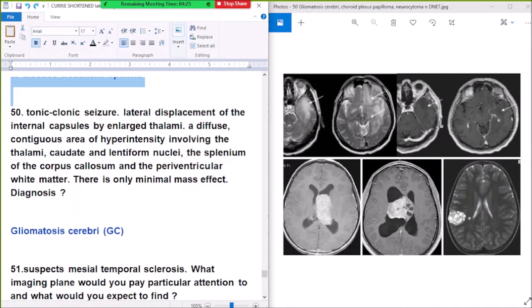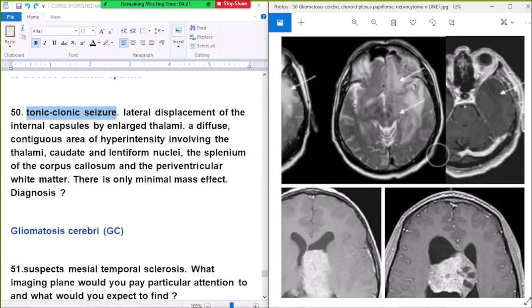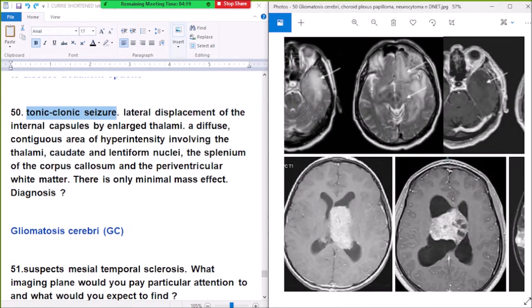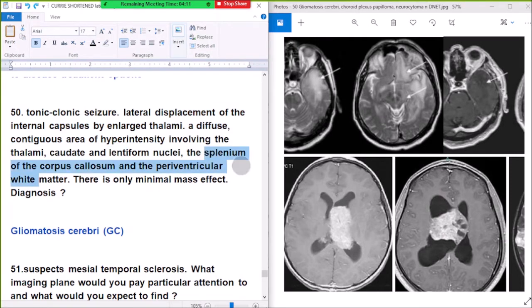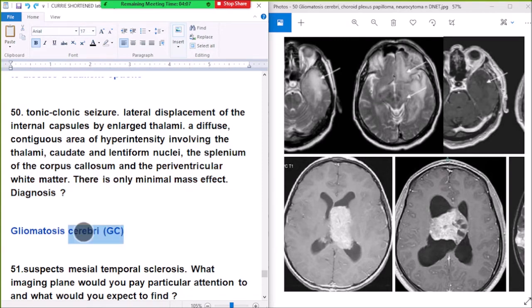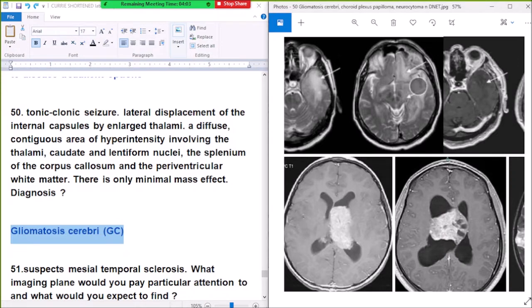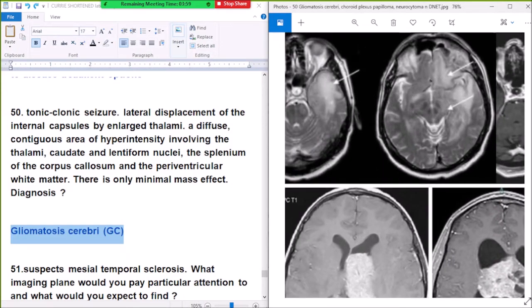Question number 50: a patient with tonic-clonic seizures. Imaging shows lateral displacement of the internal capsule by enlarged thalami, a diffuse contiguous area of hyperintensity involving the thalami, caudate, and lentiform nucleus, the splenium of the corpus callosum, and periatrial white matter with only minimal mass effect. Diagnosis: gliomatosis cerebri — these are midline tumors that show no mass effect.